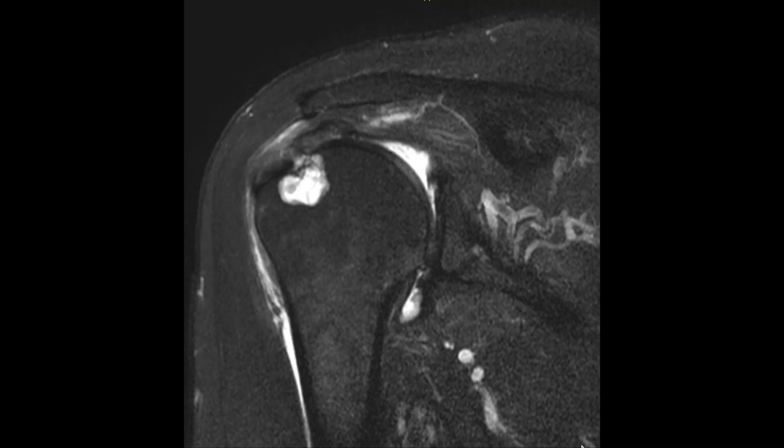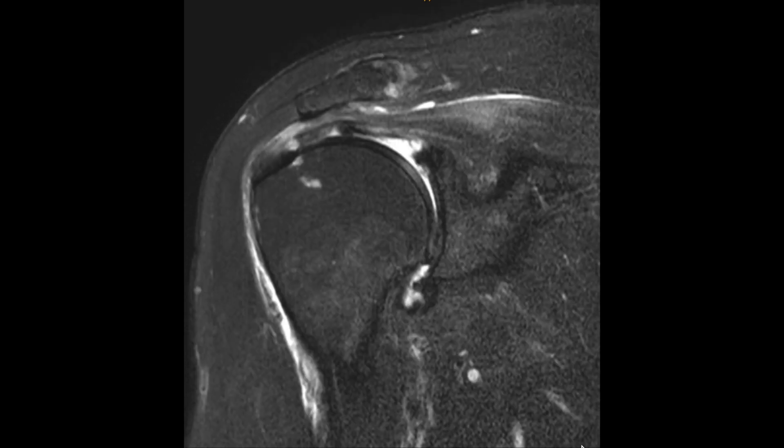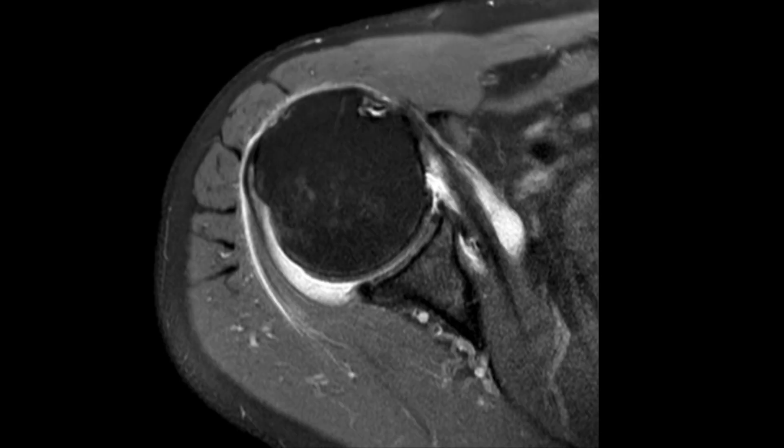This is a 66-year-old gentleman with long-standing right shoulder pain. On MRI, he has a rotator cuff tear, and at the origin of the rotator cuff tear, a very large cyst, which can be seen on the MRI.